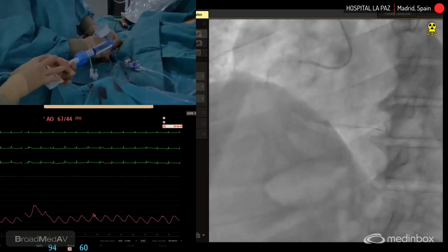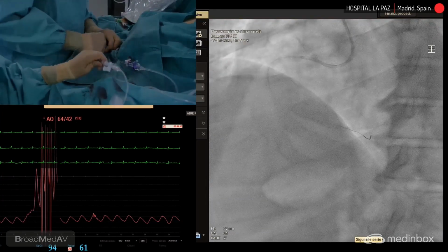Okay. Let's try to advance again the OCT catheter.